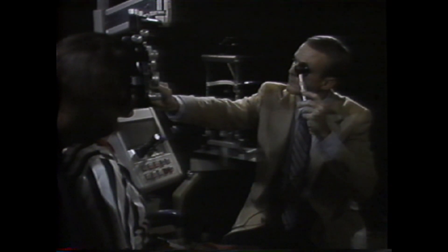Retinoscoping off axis more than 15 degrees introduces significant unwanted astigmatism. Keep both of your eyes open if possible — it's easier to do this if the room is quite dark. The best fixation target is a small light. A projected letter can stimulate accommodation, and large bright fixation targets produce annoying reflections in the corrective lenses. There is no way to avoid entirely the reflections of the retinoscope light in the phoropter lenses, and one simply has to move slightly to one side or the other to see past the reflections.